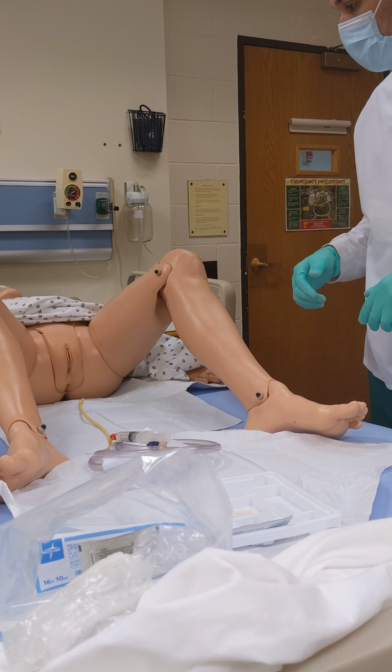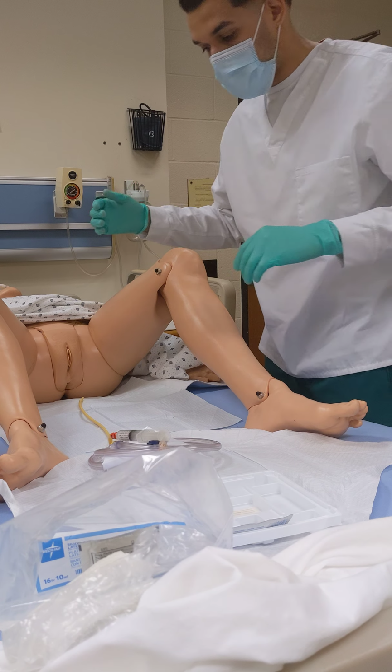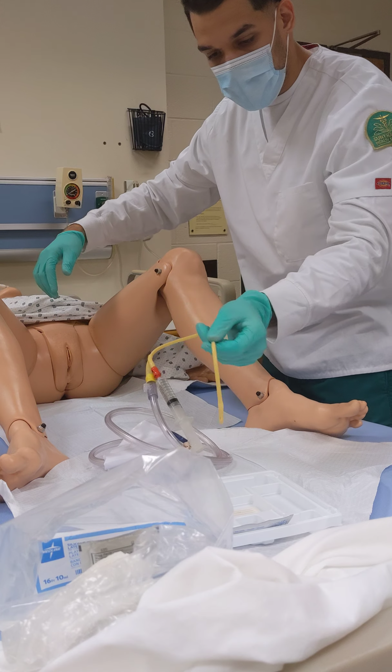So now that the patient is sterile and ready, I'm going to apply the catheter into the lubricant.